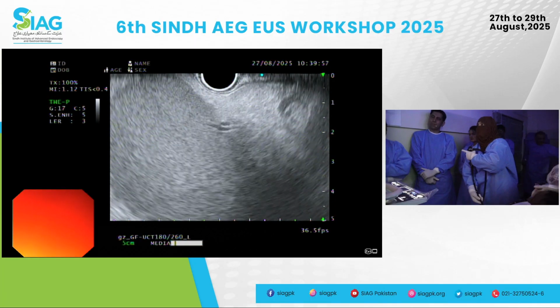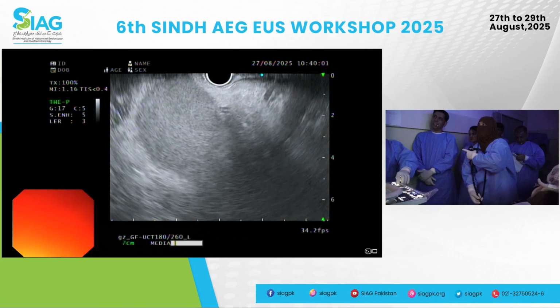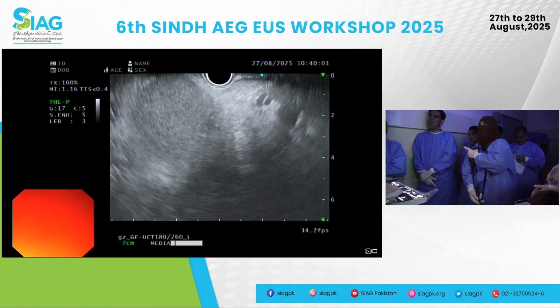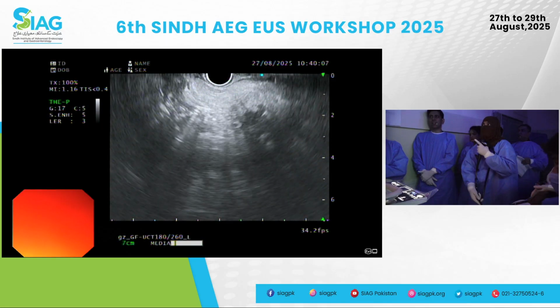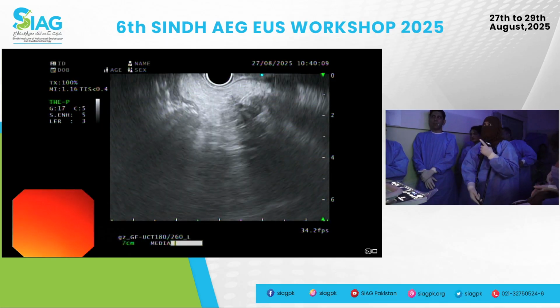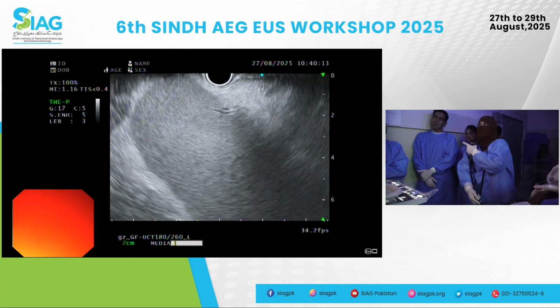Reduce this a bit so that the whole thing is on the screen. That's it. Yeah, that's fine. Back, gently. And the moment you lose it, you're back on the pancreas.